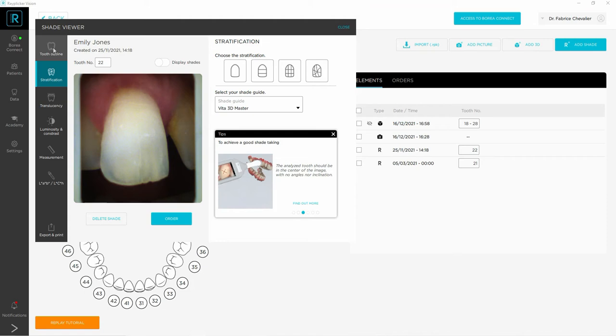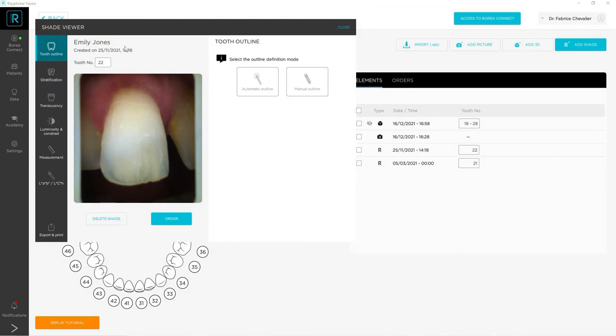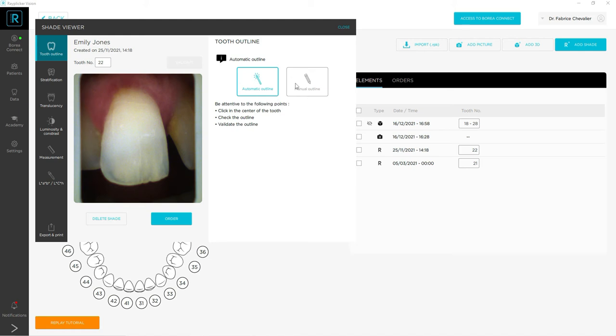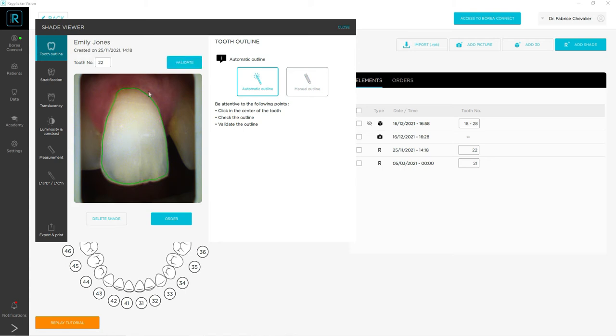The outline enables you to redo and retouch the contour of your tooth. If it has not been done correctly, you can select two modes: the automatic one or the manual one. In the first case, you can click on the tooth and you will see a green contour. If you are satisfied with it, you can validate it or you can click again and again to have a good contour.